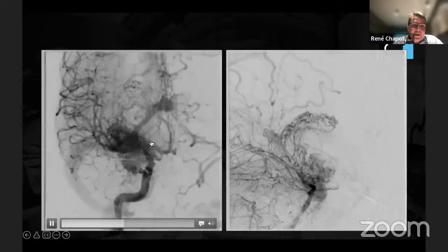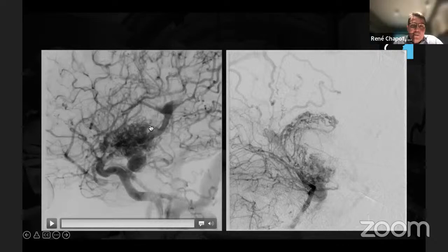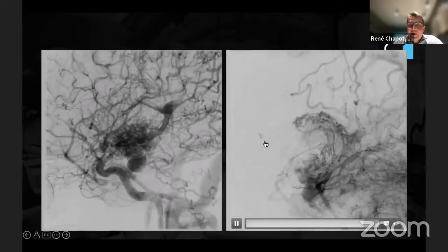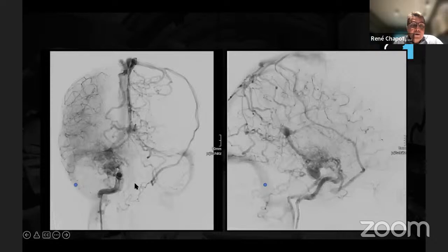You can do different rotational angiograms that show better the connection between both basal veins of Rosenthal. And finally, here is the course that we had to follow. You see the tip of the catheter in the left lateral, then the superior sagittal. Look at the lateral view. Now there's always a U-turn, getting down that vein, now around the temporal lobe, arriving in the left basal vein and getting up to the right basal vein. And indeed, with some patients, it works.